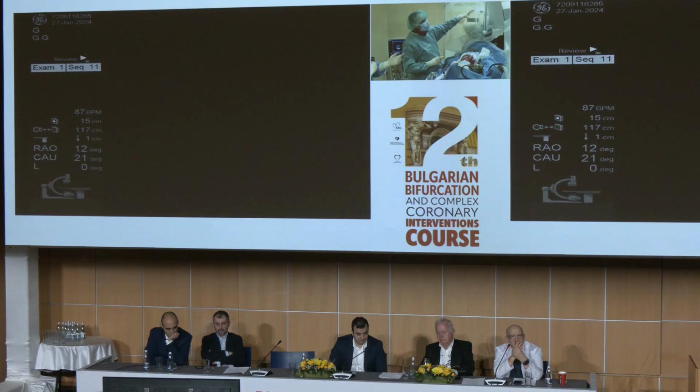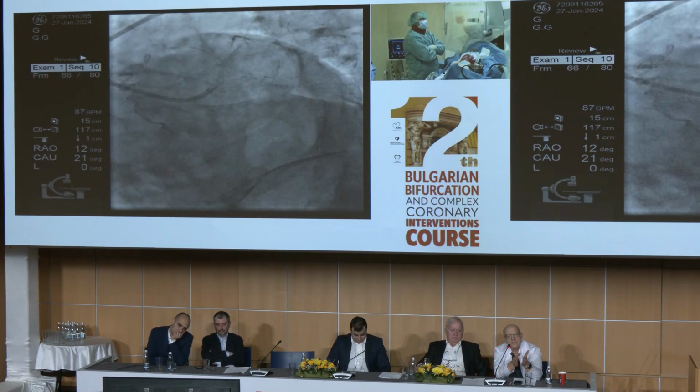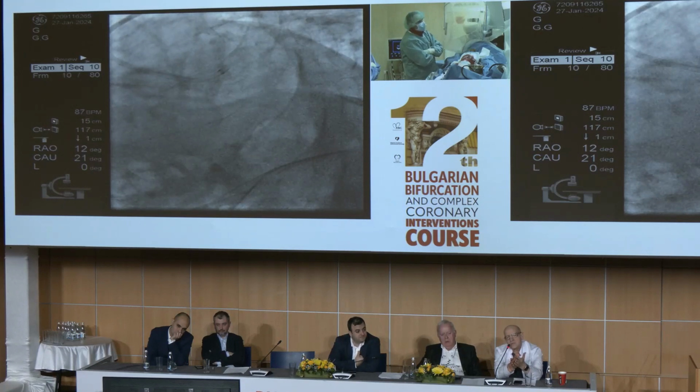Yeah. We know that these vessels for sure are ectatic after this stenosis, and the distal vessel is not that big.